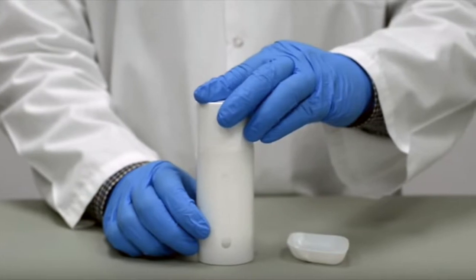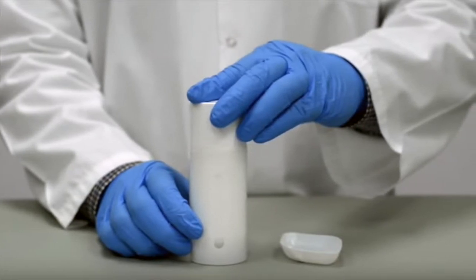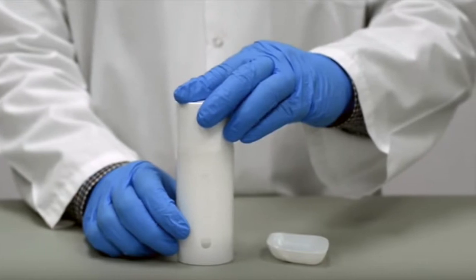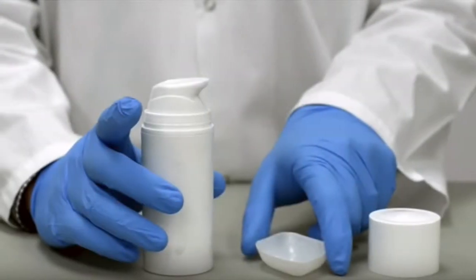This video will show you how to properly use your pump medical device. First, remove the cap by gripping firmly and pulling it off.